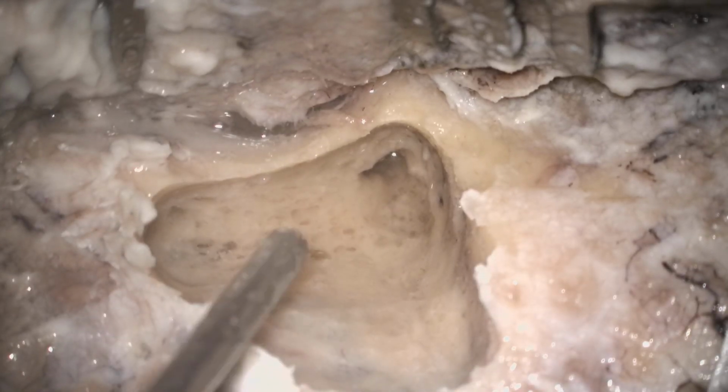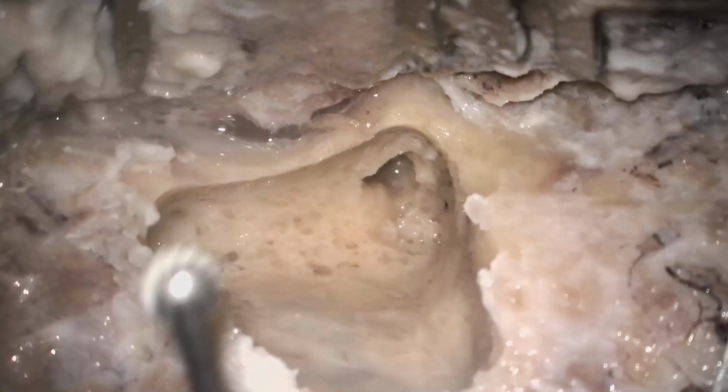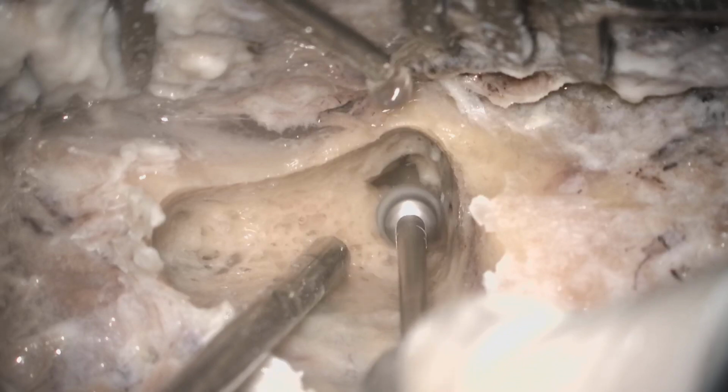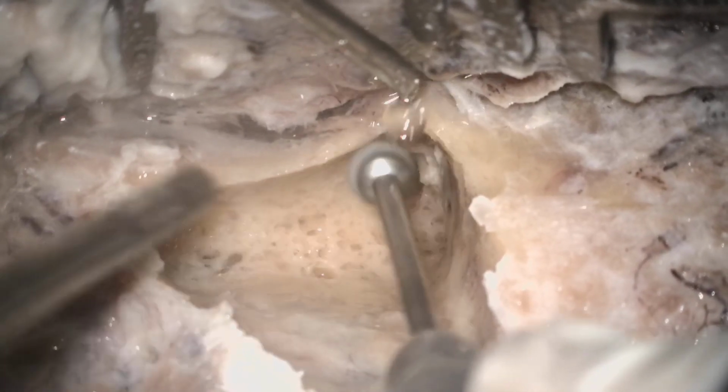If any structure is hidden just away from your visibility, then you put some fresh saline or water, and you can visualize the structure by refraction of the water, and then you will have some idea that yes, your incus or your important structure is nearby. You can drill according to that situation. You should use a smaller bar.